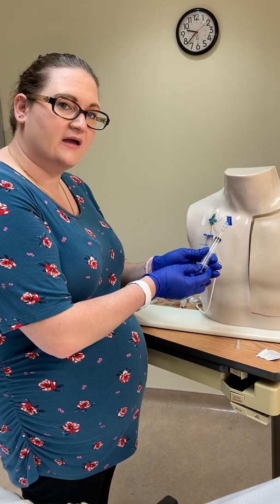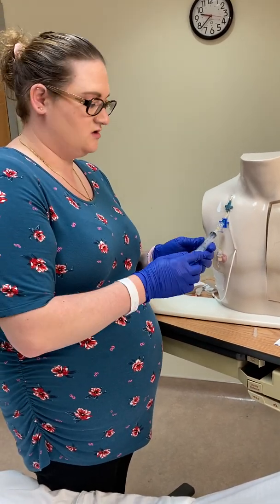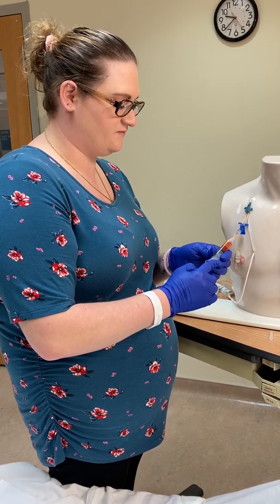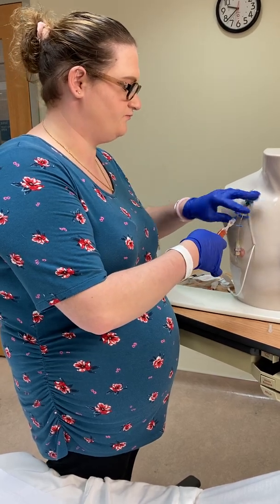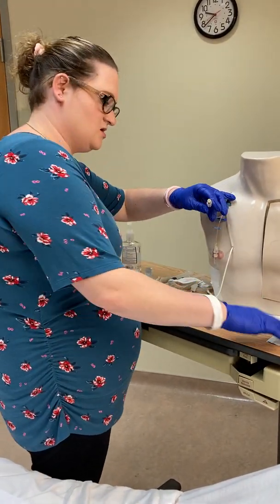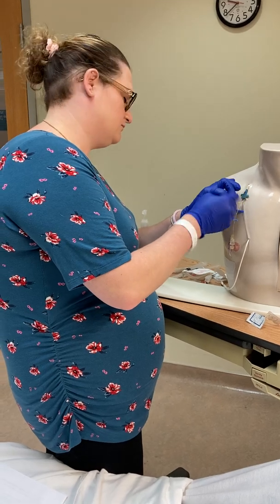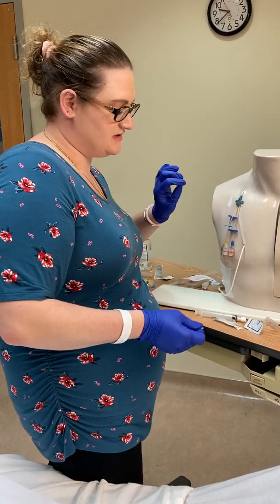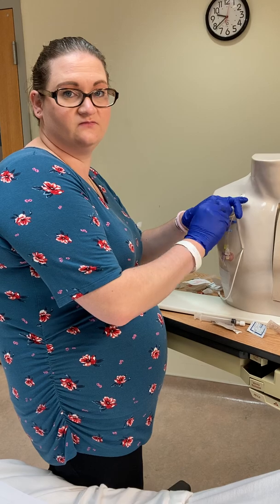Pull back a minimum of 6 mls per Elsevier guidelines — typically we pull back what we flushed, so in this case 10 mls. This discard syringe goes into sharps. Make sure the line is clamped before removing the syringe. Then scrub again for 15 seconds. If you drop the alcohol swab at any point, get a new one and re-clean for the full 15 seconds.